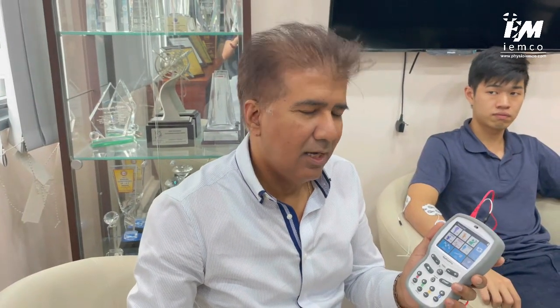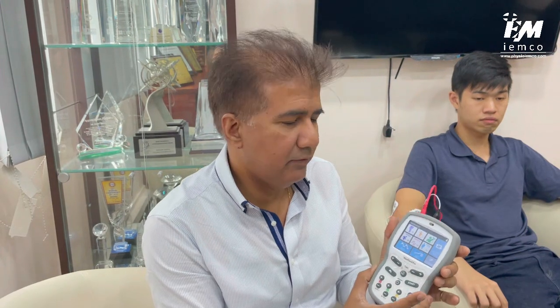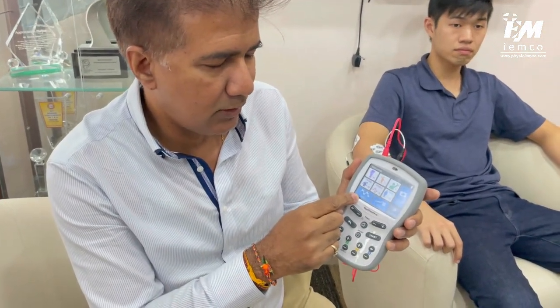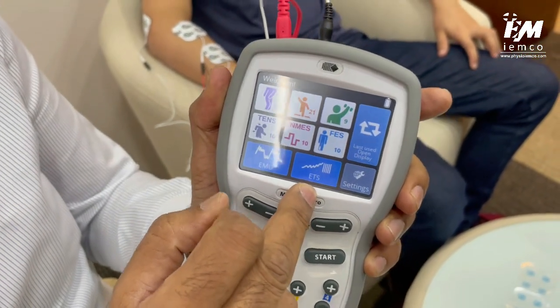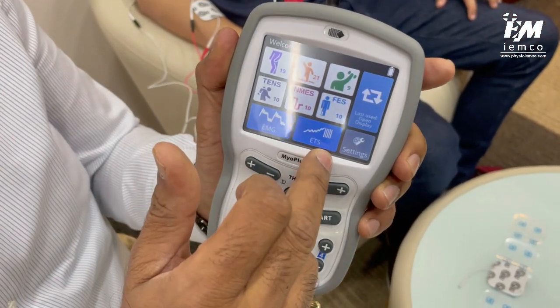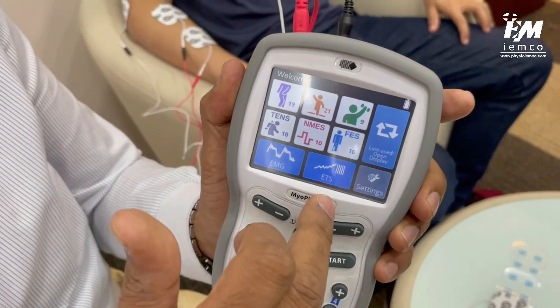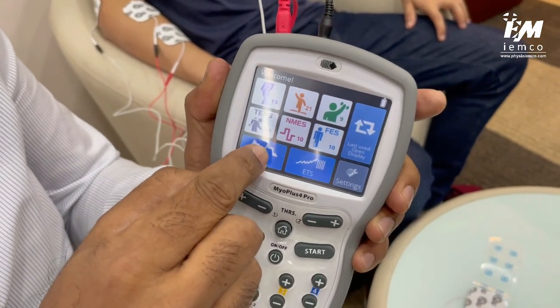I'm going to show you the MyoPlus Pro EMG biofeedback device. It's a very comprehensive device which gives you EMG but also has some e-stimulation capabilities, which we're not going to talk about right now. What we're going to focus on here is the EMG icon, and next to it you'll also see what we call ETS — EMG trigger stimulation — which is a combination of using EMG together with electrical stimulation. For this moment, we're going to just focus on EMG.